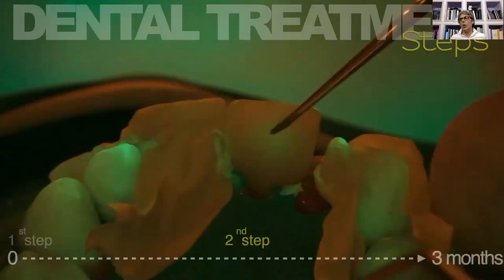After removing the excess of cement, we light cure each side of the restoration for 90 seconds. And after that, I always activate the fluorescence mode of my microscope that highlights the composite excess of the cement that I use to cement each restoration. And carefully with a curette, we can remove this residue of composite cement, avoiding touching the thin cervical third portion of the veneers, avoiding fracturing this part of our definitive restoration.